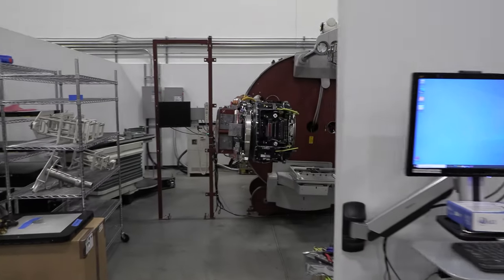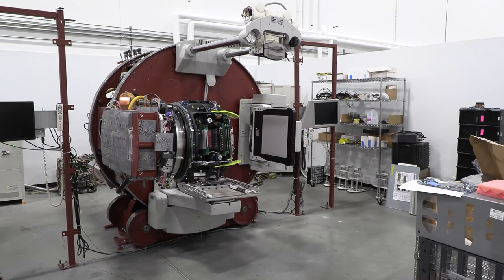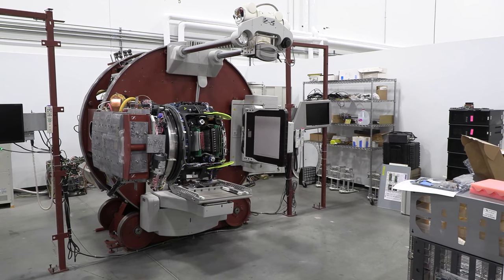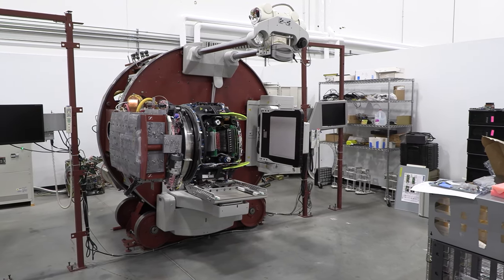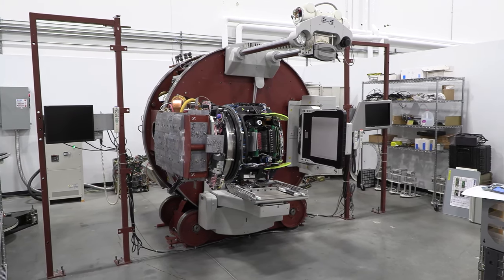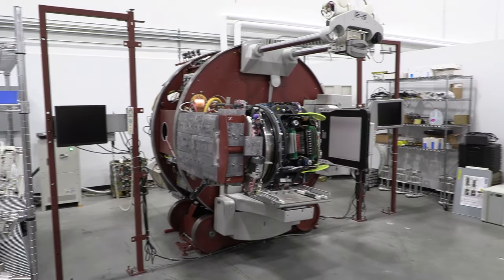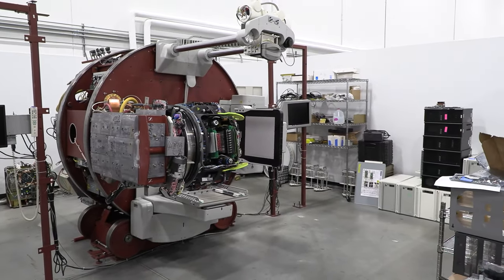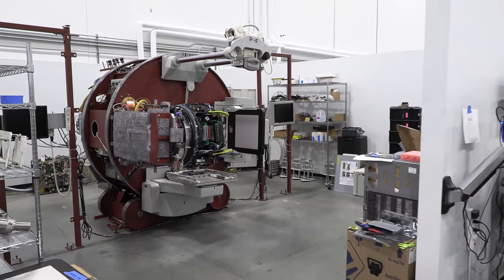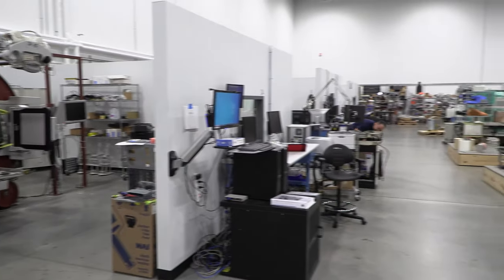They do theirs on a drum style versus a gantry. Oh, okay. Well, that's different. So yeah, basically a big drum that goes around on four giant bearings. Wow. That is massive. That's very cool. I see all the counterweight plates and stuff. Very neat. Yeah, this is the first time I've ever looked inside a linear accelerator. Very cool.